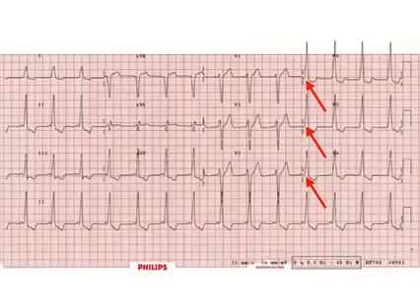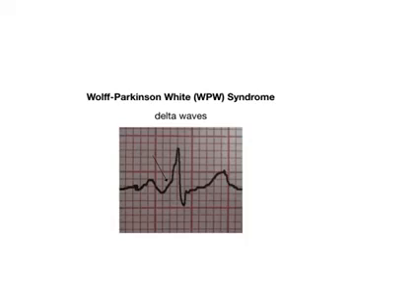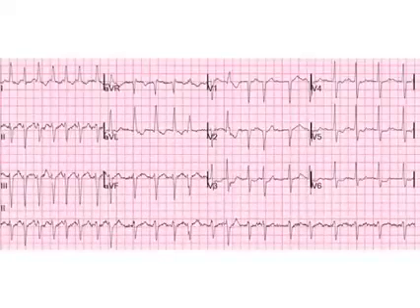And again, I'm just really going to hone in on this. You don't have to dissect this ECG and go, rate, what's the rate? Rhythm, what's the rhythm? Axis, what's the axis? You see the delta wave, the answer is WPW. So what is the point of doing the methodical, unnecessary waste of time method that you're seeing in all these other YouTube videos, okay, guys? Look for the pathological findings and answer the question. It's that simple. WPW has the delta wave that upslants. Done, moving on.